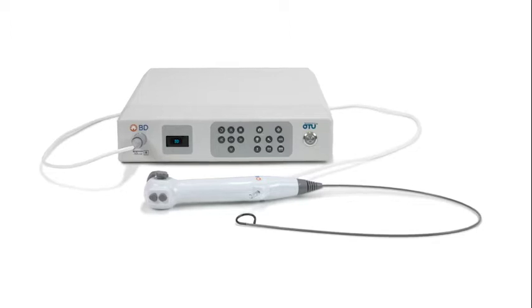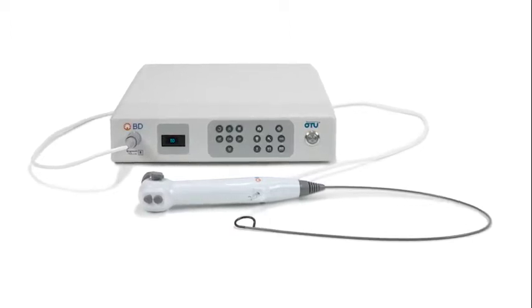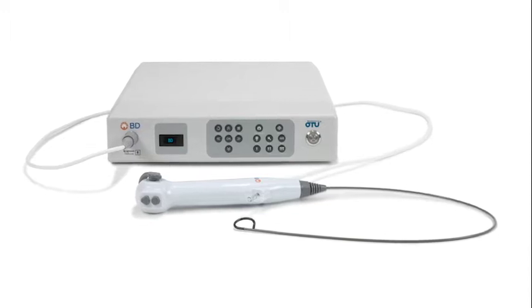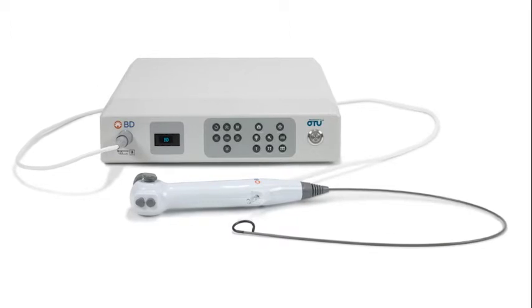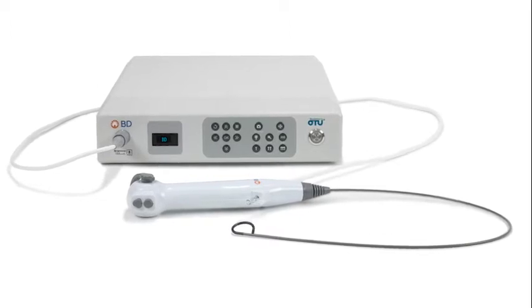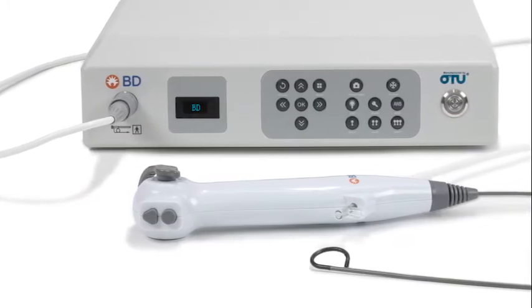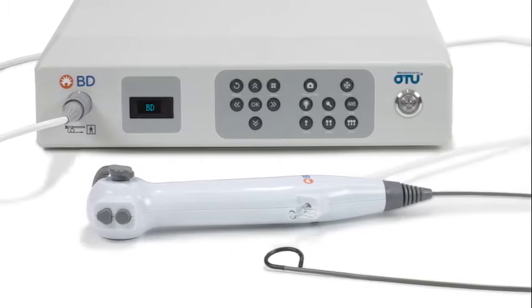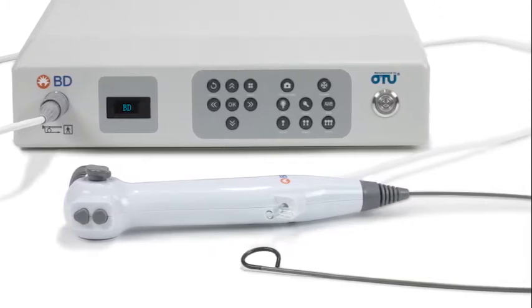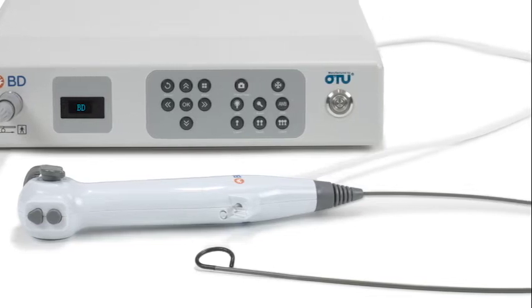The BD-APTRA digital endoscope system is intended to be used by physicians to access, visualize, and perform procedures in the urinary tract and the kidney. The instrument enables delivery and use of accessories such as biopsy forceps, laser fibers, graspers, and retrieval baskets at a surgical site. Please refer to the user manuals of the BD-APTRA image system and the BD-APTRA single-use digital flexible ureteroscope for additional details and usage instructions.